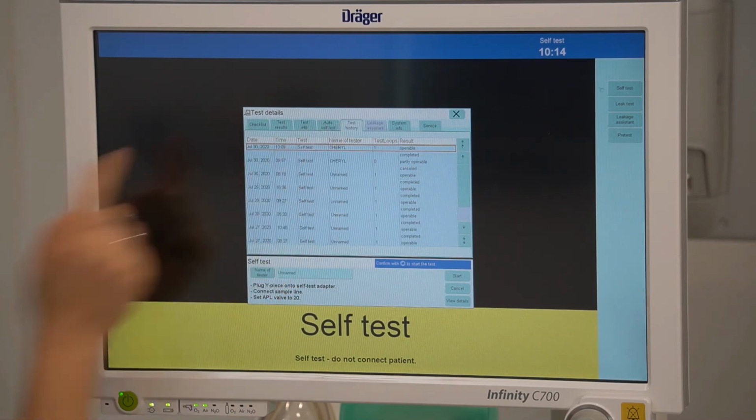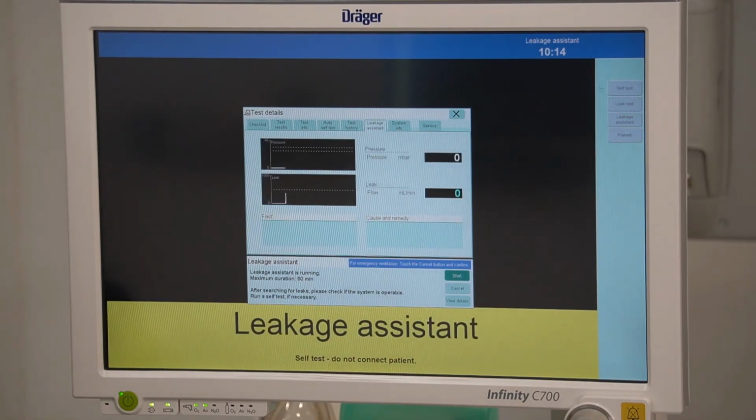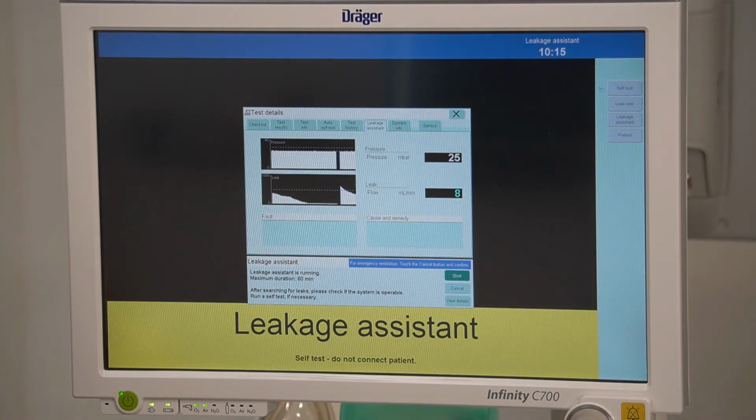In addition to the image, important system data is displayed to the left of this dialog window. Leakage and compliance values with a date and timestamp are displayed here, alongside central and reserve gas cylinder pressures. Diva metering modules are located here and the internal battery capacity is displayed. Once a problem has been addressed or rectified, select repeat pretest and confirm with the rotary knob.